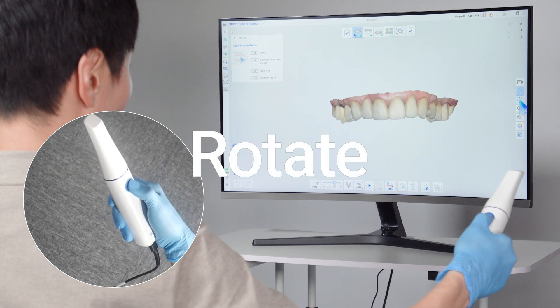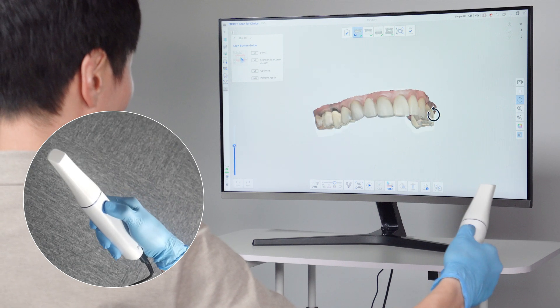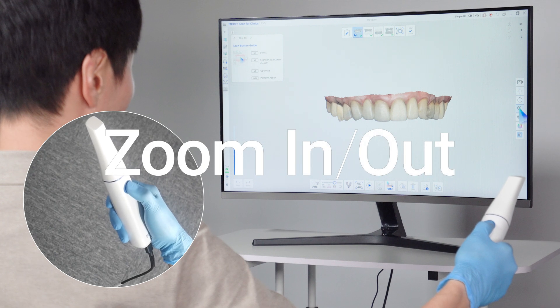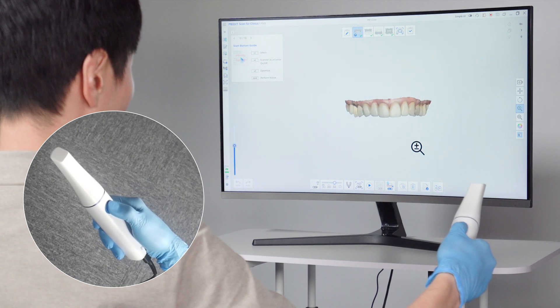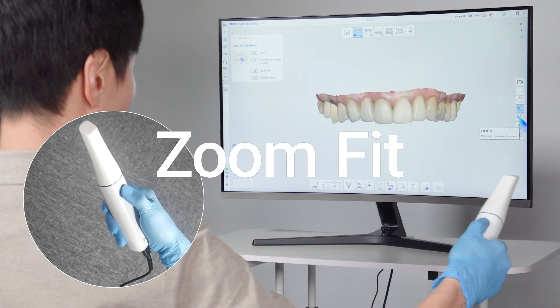Similarly, click the rotate icon, then hold the button and move the scanner to rotate the data. To zoom in or out, click the zoom in/out icon, hold the button and tilt the scanner up or down. Click the zoom fit icon to center the data on the screen.